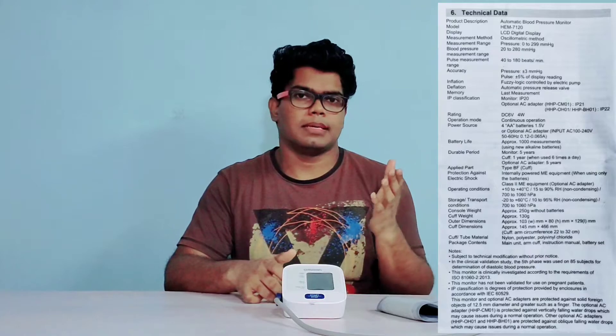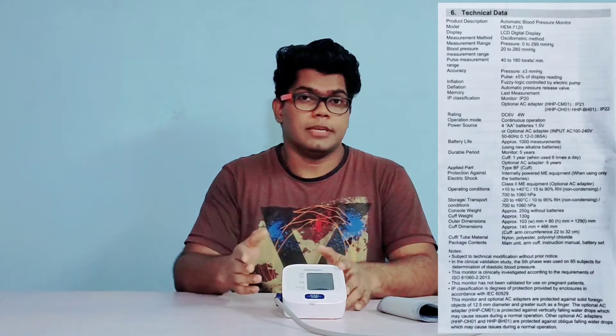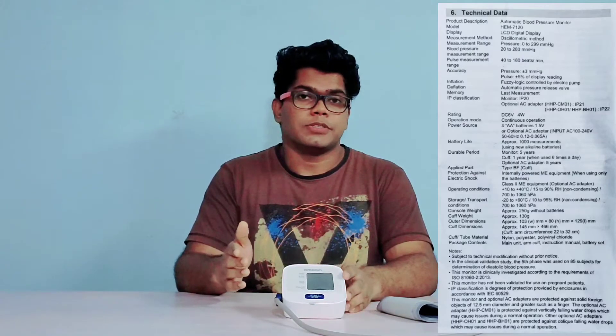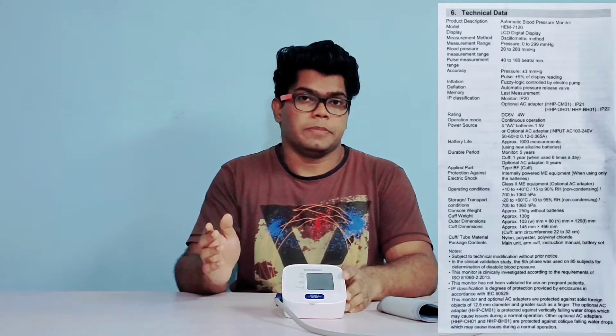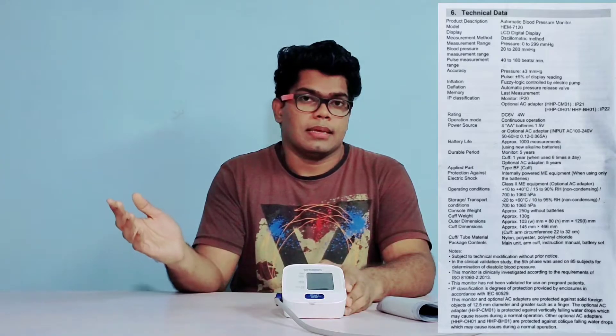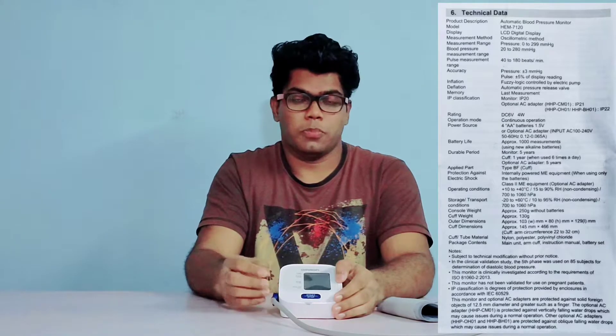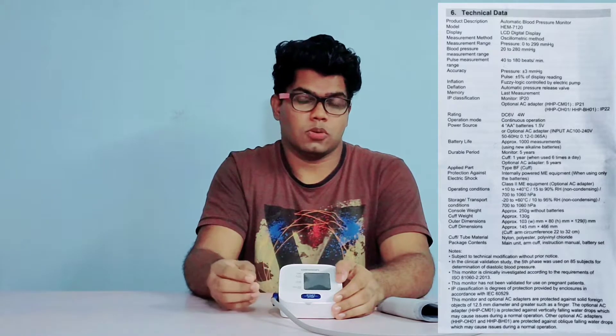Here is the technical specification list. It uses an LCD display and works on oscillometric method. The measurement range is 0 to 299 mmHg, blood pressure measurement range is 20 to 280 mmHg, and pulse measurement range is 40 to 180 beats per minute. Accuracy is plus or minus 3 mmHg in blood pressure monitoring and plus or minus 5% in pulse monitoring. This BP monitor has an IP20 rating, meaning there is no protection from water damage, drops, or scratches — so keep it safe and away from water.